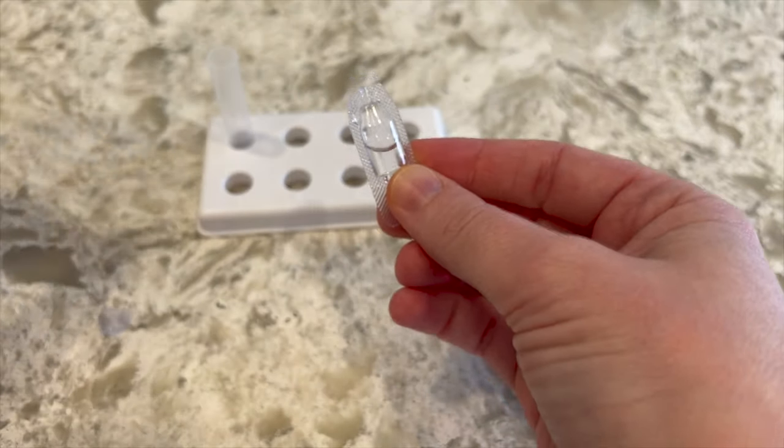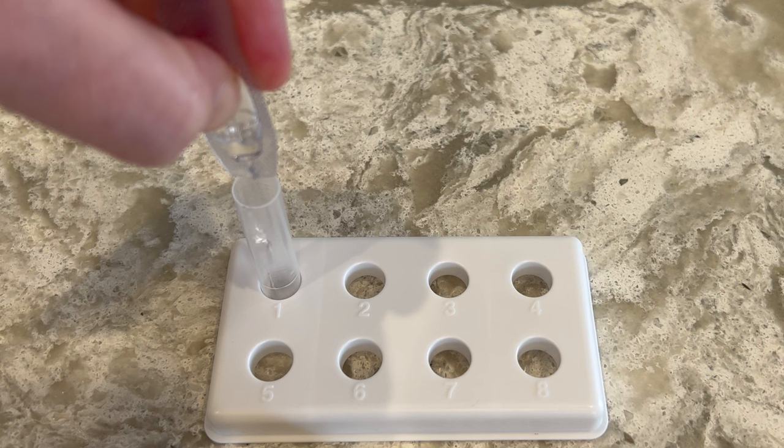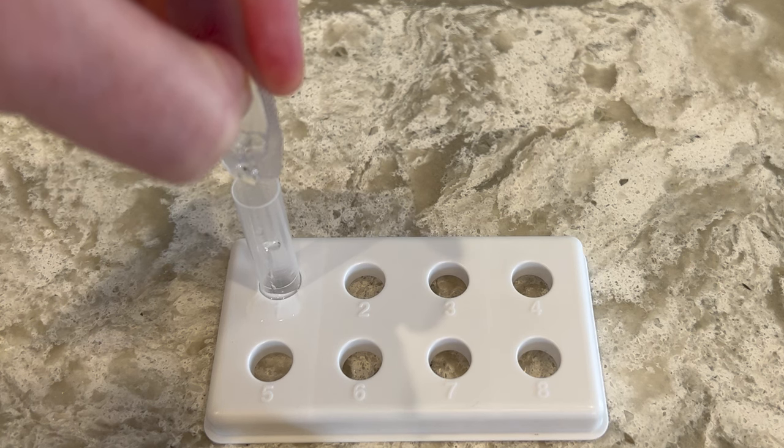Twist the cap off of the buffer liquid and insert 10 drops into the test tube, or if you prefer, you may empty the entire quantity of buffer liquid into the test tube.